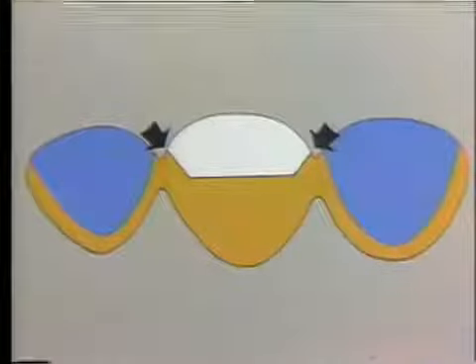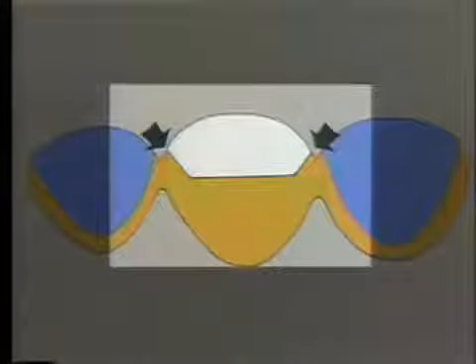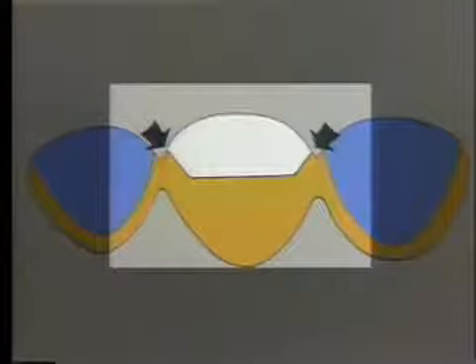The critical nature of this relationship between porcelain and gold here is shown in this other illustration, where the arrow points to that situation. The two blue teeth on either side represent abutment teeth with, say, pin ledge retainers around them seen in cross-section, and you see there the connectors, the soldered joint between the retainer and the Pontic, and how close that comes to the gold into which the porcelain is seated. And you can see that that positioning there is quite critical and has to be worked out on your lab model when these are being constructed.